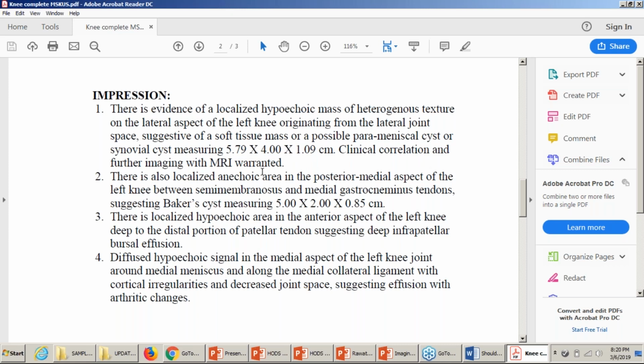So especially when you see any finding where you don't see the complete structure with ultrasound, you have to make sure that you write that the patient needs further imaging. So any intra-articular pathology, like if you see meniscal pathology in the knee, parameniscal cyst, or paralabral cyst in the shoulder, you have to write that this patient needs more than ultrasound. You need an MRI scan for this patient too, and then you go on and describe what other soft tissue structures appear in the knee area.